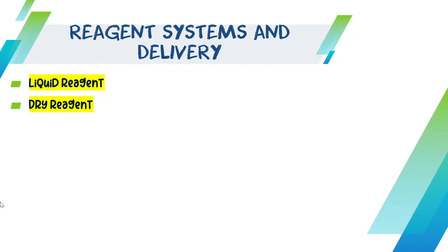So, I hope nasabtan to siya. Now, in terms also of your reagent, naa pod ay two types. We have your liquid reagent and your dry reagent. Syempre, understandable when we say liquid reagent, meaning in a liquid form, and mao yun na siya ang kadalasan na inyo makita. But there are also reagent na kaning gina-tawag nato na dry reagents.